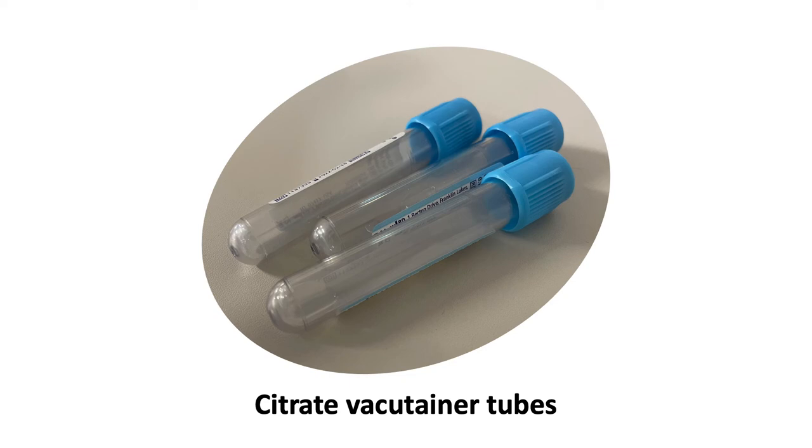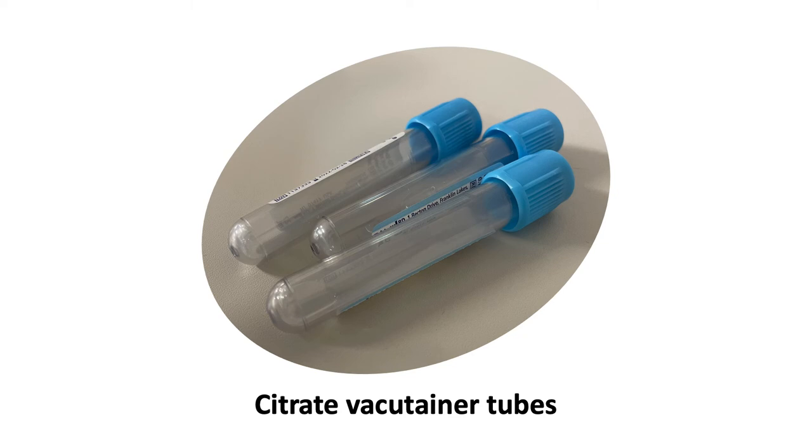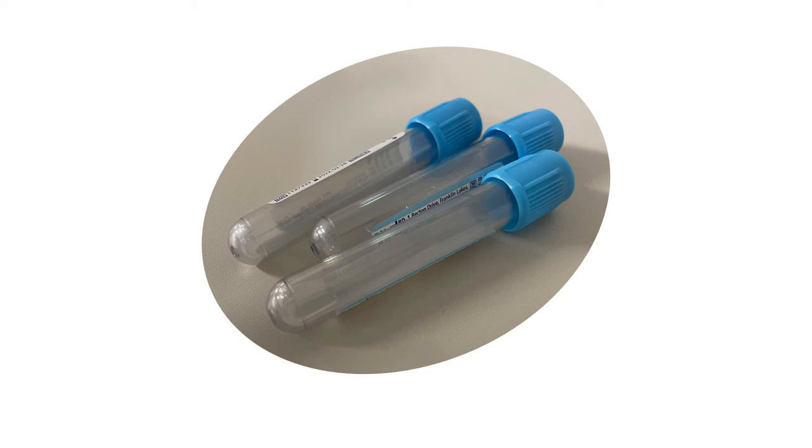To avoid testing errors, tubes should be completely filled. Immediately after phlebotomy, tubes should be inverted gently to mix in the citrate. Tubes should not be shaken so as not to cause hemolysis, which gives inaccurate results. The sample should be processed and tested within hours of collection.